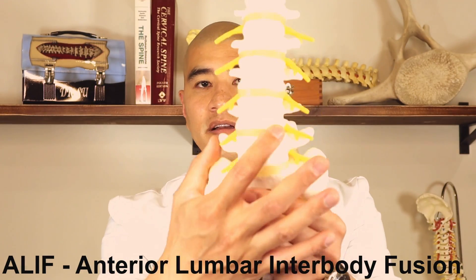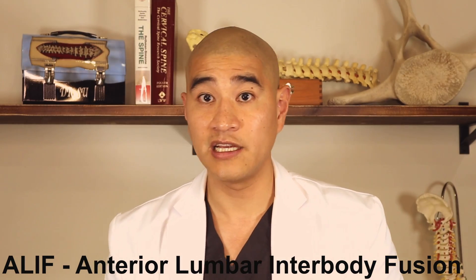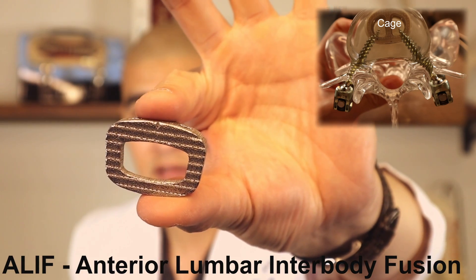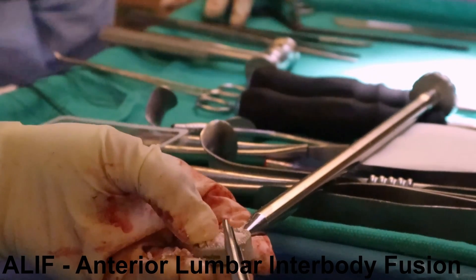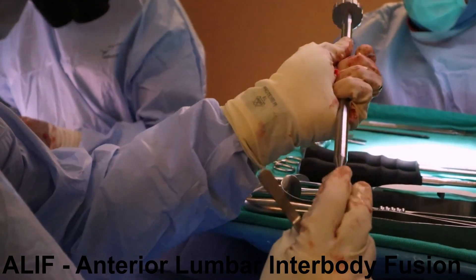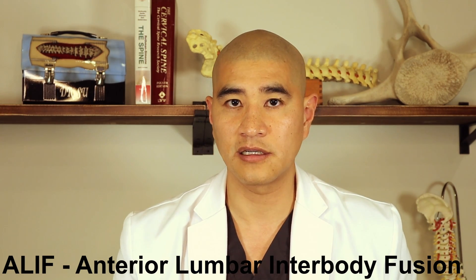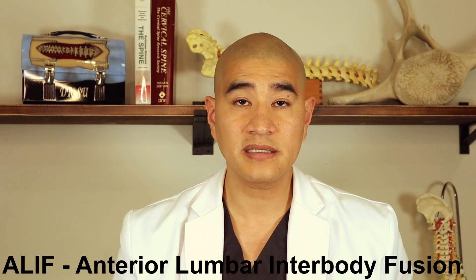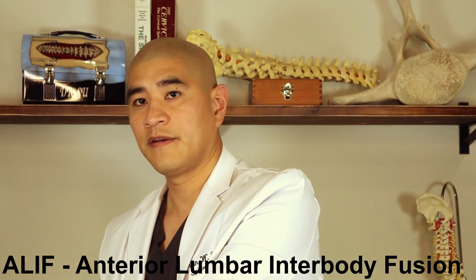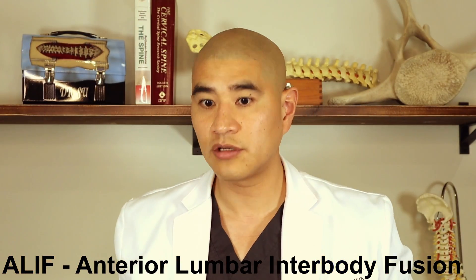If you're a guy that wants to have kids, I usually recommend donating to a sperm bank before an anterior lumbar interbody fusion just in case. Once we expose the disc in the front, we take the disc out in entirety and in its place we put a cage — usually quite a large cage. This ALIF cage has a hole in it and it's filled with a bone growing substance called BMP, which is a very powerful bone growing substance. At the doses we use, there's no proven cancer link, and the fusion rate with BMP is almost 100%.